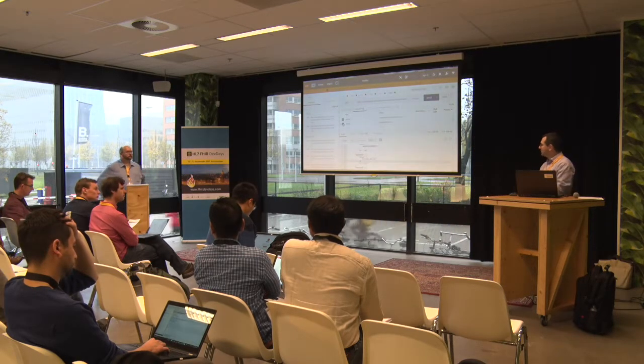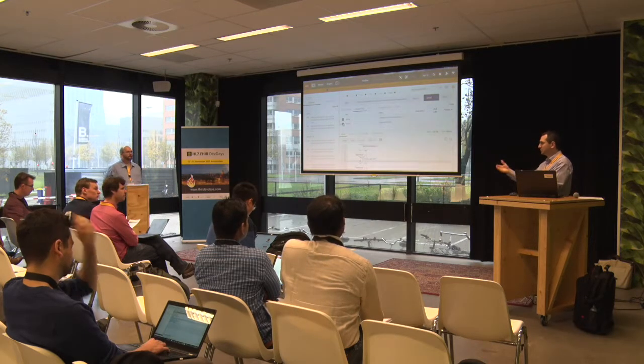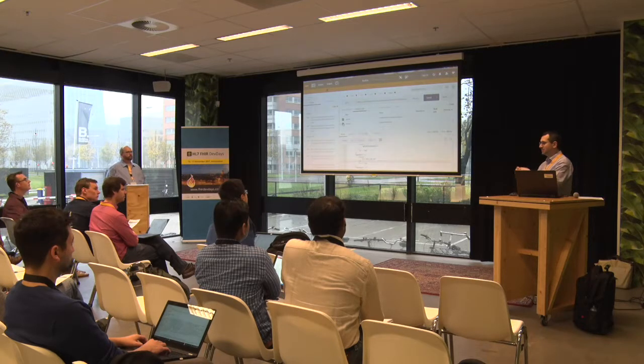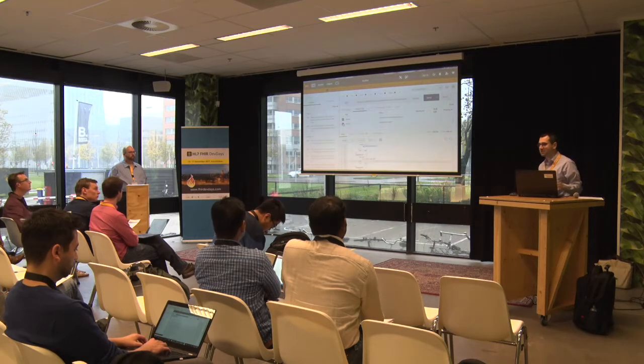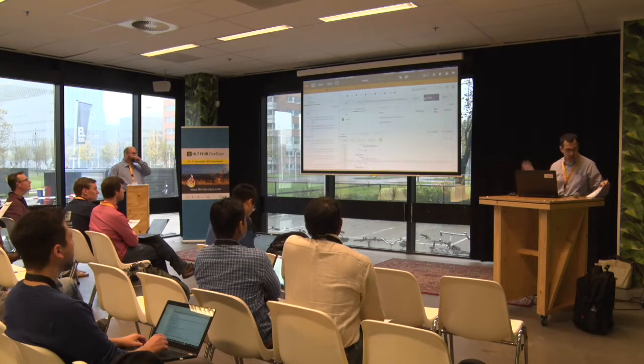Yes, and one other reason why these tags exist is that originally when it was developed, it was mostly sequential reading, because these things were being read off tape. So if you're reading a 1 gigabyte object off tape, you couldn't easily read the whole thing in one go. You had to read one bit at a time. That's part of the reason why it's got all these weird tags and structures. And again, you have to keep it backwards compatible to this day. I'll switch back to XML for the sake of this.